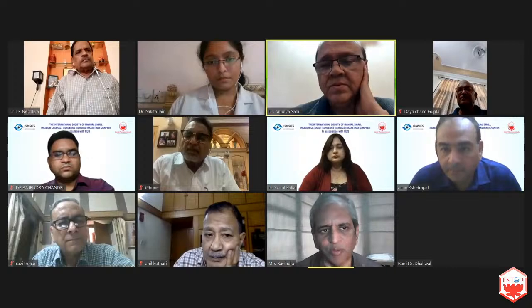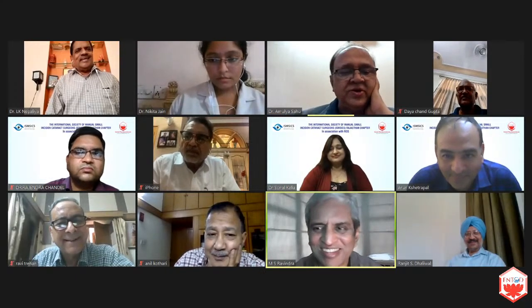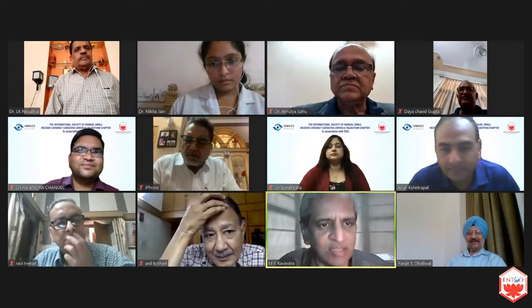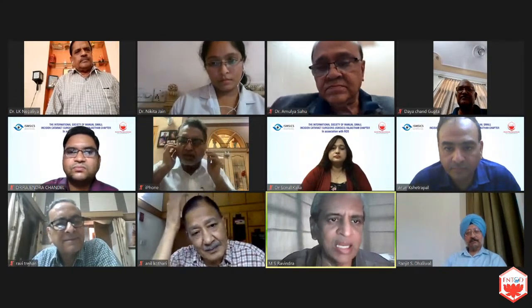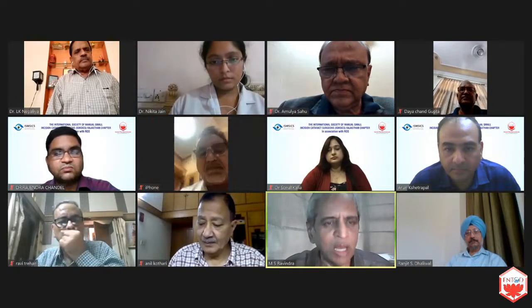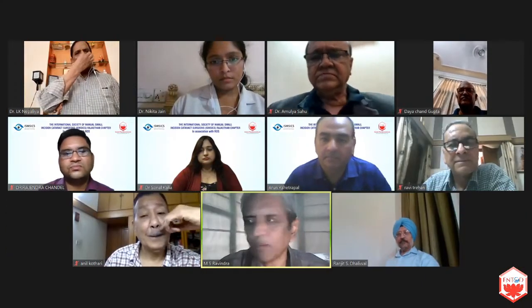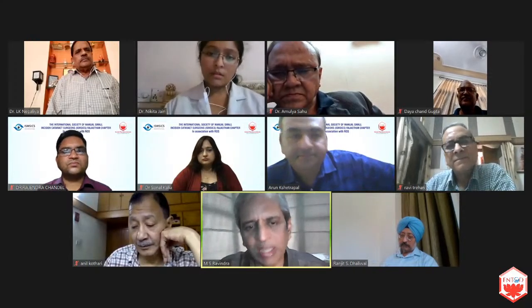I think what Dr. Jain said is... please talk loudly, Ravindra, please. Okay. You are not talking to yourself. We have to listen. Imagine you have selected a lens of 20.5 for a posterior chamber implantation. 118.7 is a constant. It will be about quarter to half diopter lesser if it is in the sulcus, not more than that. Ultimately, you have to check how much optic haptic angulation there is. Some of them have angulation, some of them are planar haptic. If it is planar haptic, it is half diopter, you can take it. AC is about 1 diopter, 1 to 1.5. 117 is the A constant. So it's about, as you said, 2 diopters, 118. But 1 to 1.5 diopters lesser than your PC lens. So 2 to 3 diopters will be too much.